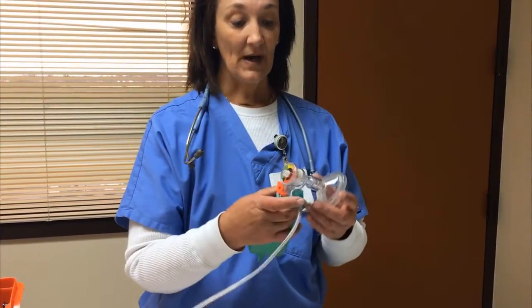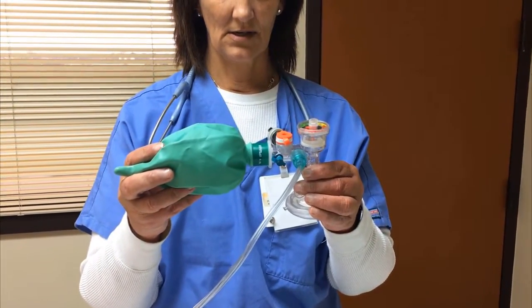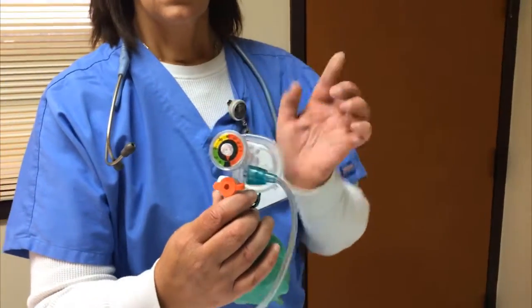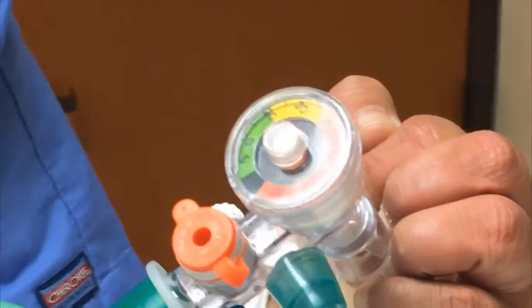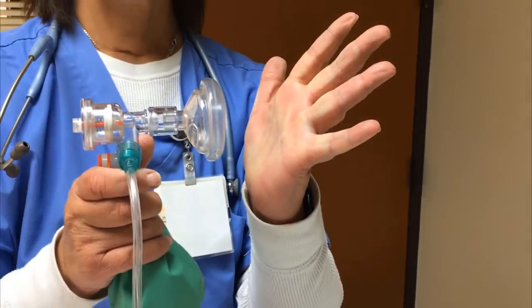So when we're using CPAP, we're going to be using the flow inflating bags that we discussed in earlier lessons. And we're going to look at the manometer, okay? It's really important that we check the manometer to see what the PEEP is when the mask is occluded.